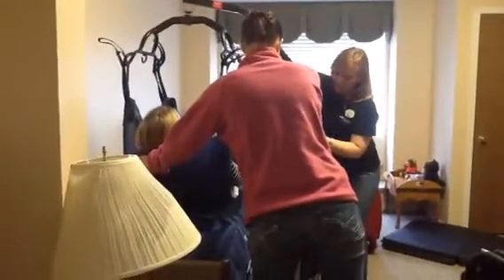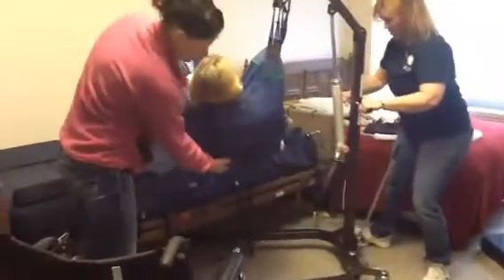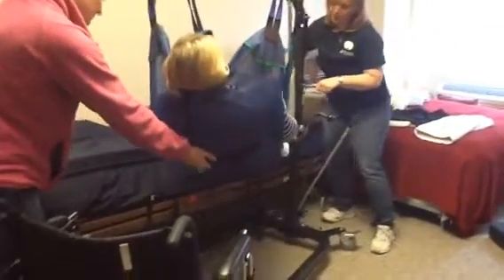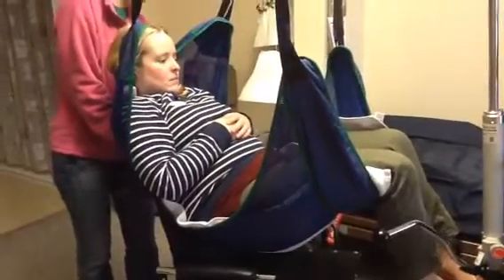So with the help of your second person, you move the lift. Your second person helps to guide. And you bring them over. And you have to watch their feet. And then you need to open up the Hoyer, so the chair can then go right through it. You guide it right up. Your chair is locked so it doesn't move.